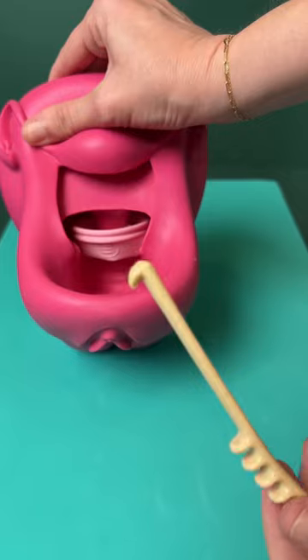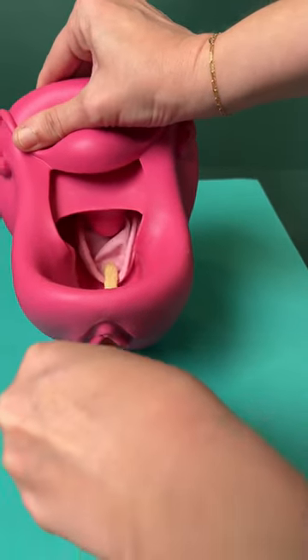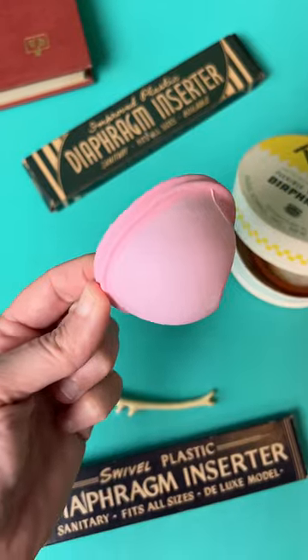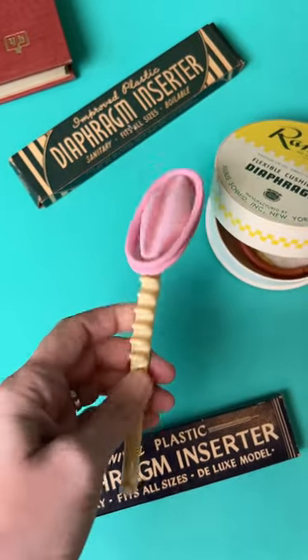They recommend for removal to turn it around, hook the top of the rim, and pull downward — but if you're using this for periods, that would be a mess. Tools are always more difficult to use because they don't have the same sense of touch as your hand. Full disclosure: I have not tried this yet because it's vintage.